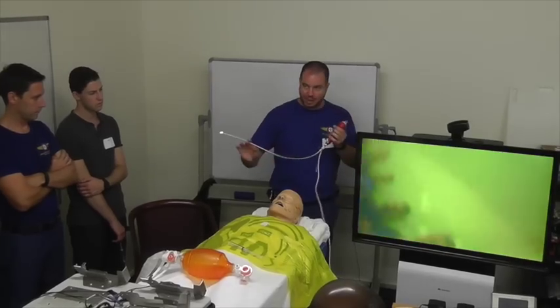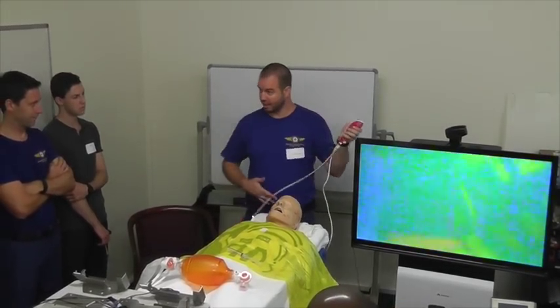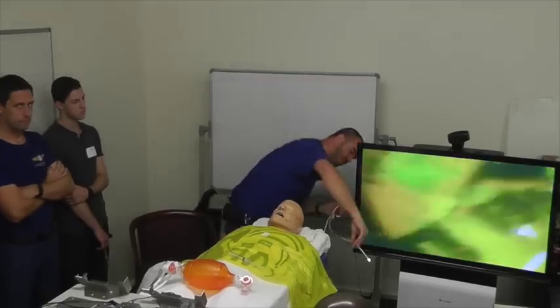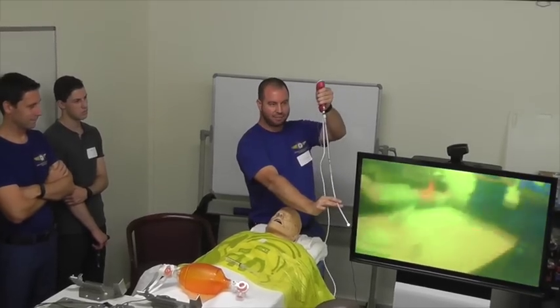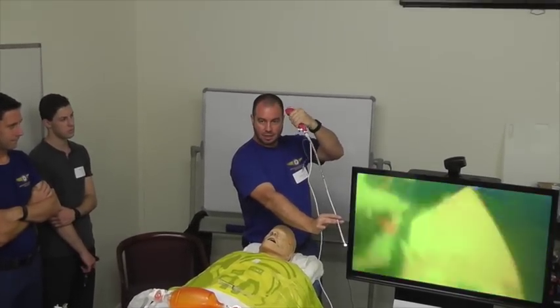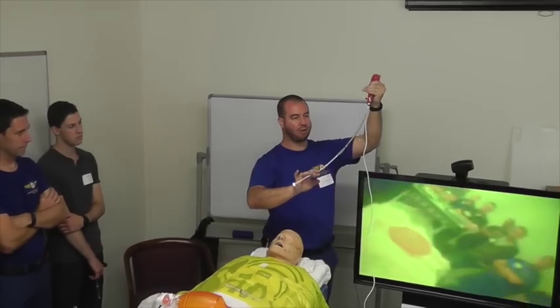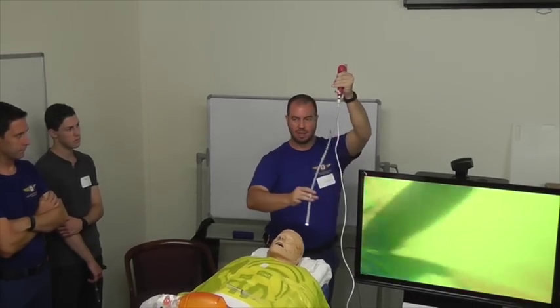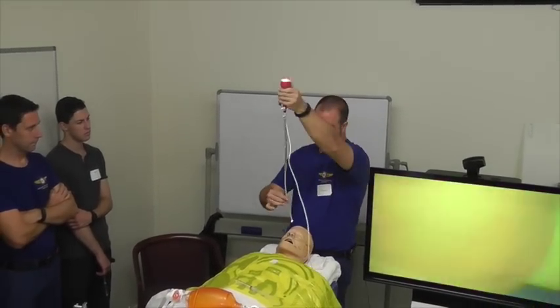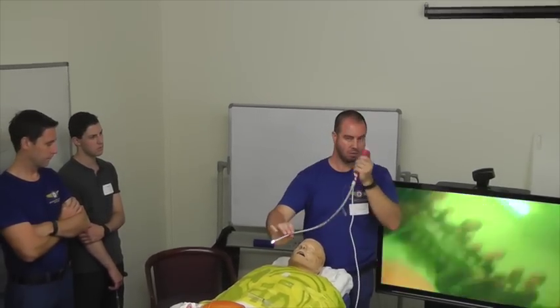One of the main things about fibre optic intubation is you want to look good doing it. This is not gastroenterology where we're doing this with the long black snake. It's fine finessing movements to get control. To do that, we need to get all of our spare loops out of the cord. We've got to have our arms up high, and we've got to use our deltoid muscles, and we've got to think of the natural curve of where we're going to be going in.